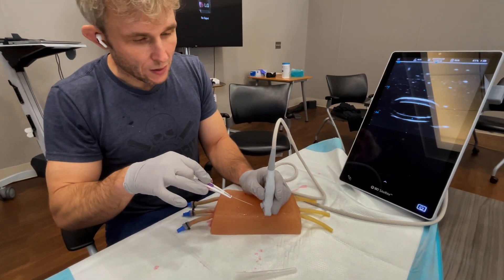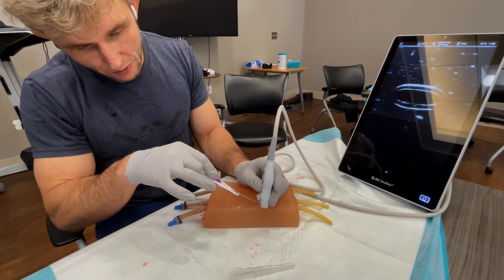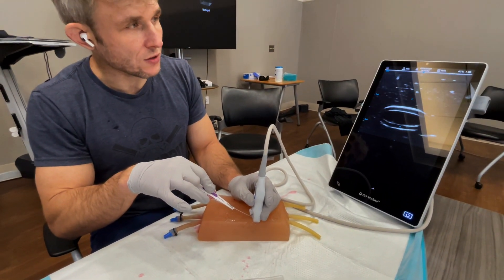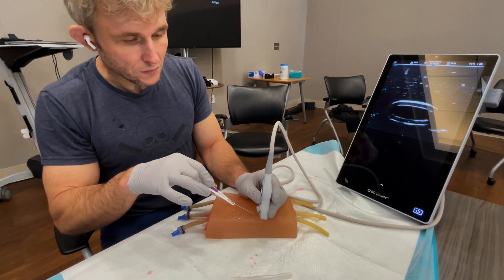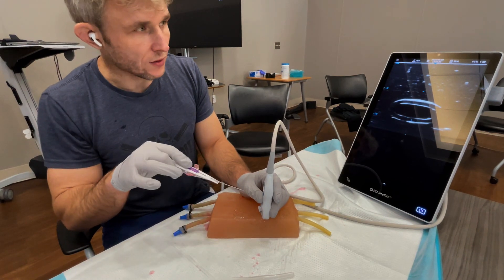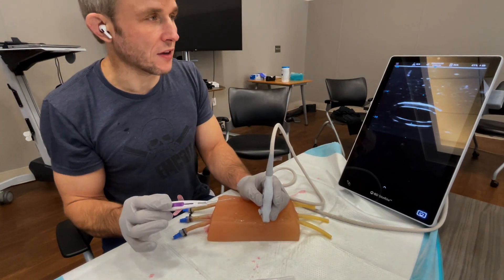The next step is entering pretty close to your ultrasound — in fact, where I enter the skin is directly under the ultrasound. Most of the time these vessels are pretty superficial, so if you enter with too much space between your skin entry point and the ultrasound probe, by the time you see your needle on the screen you'll often already be past the vessel.